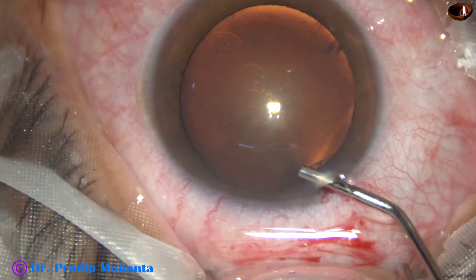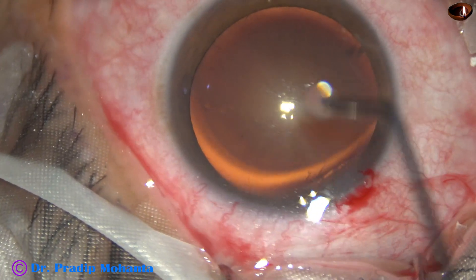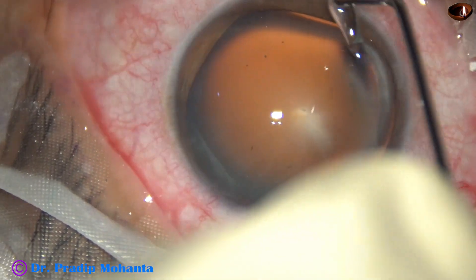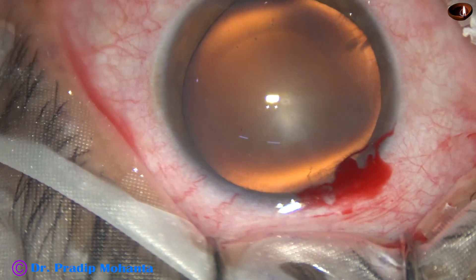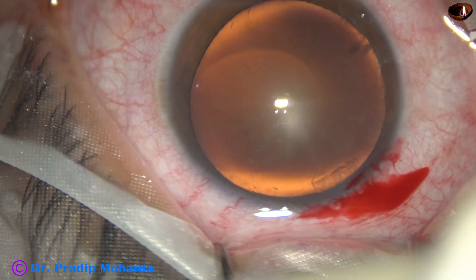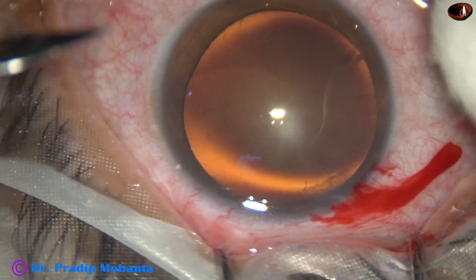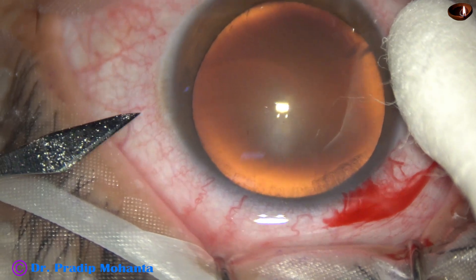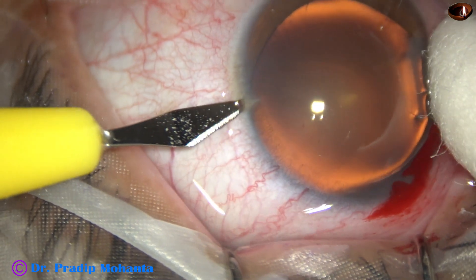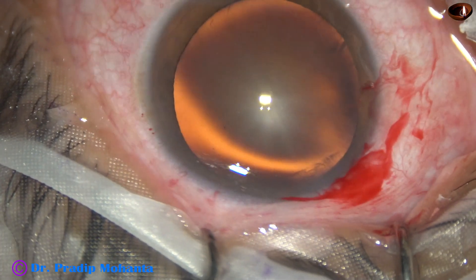The anterior chamber is filled up with 2% hydroxypropylmethylcellulose and it is applied over the cornea for better visibility. A side port is made on the left side of the main incision, about three o'clock hours away from the main incision.